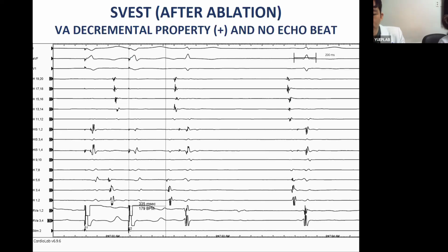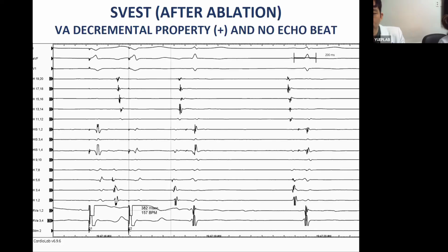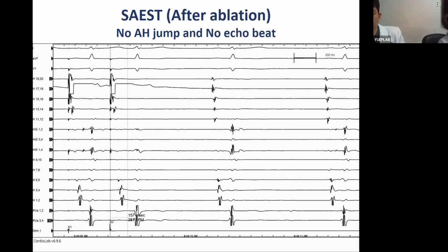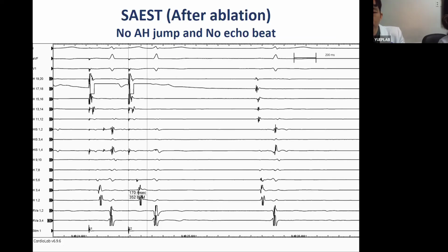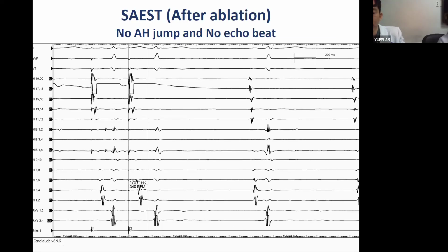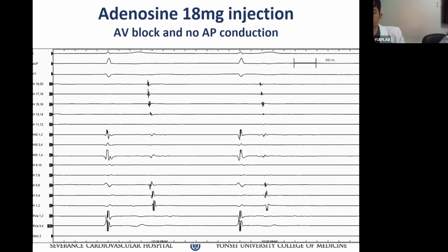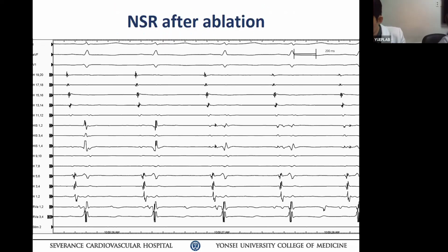There's still junctional rhythm there after pacing. Maybe doing either atropine or something, I don't know. Okay, oh, there we go, Doctor. No delta there now. Yeah, it's normal. Maybe use the big one on the other machine and you want to focus on it. This is different times for the calculation.